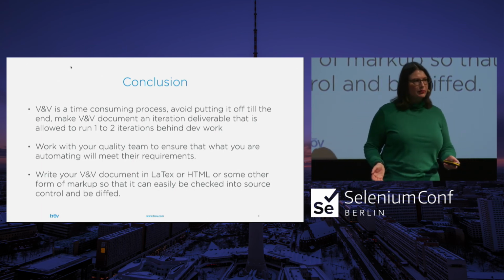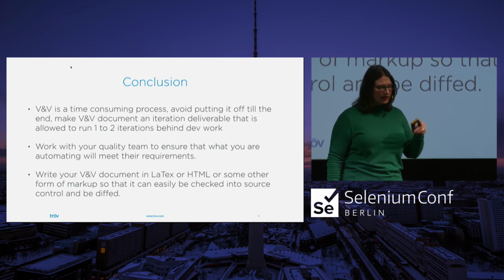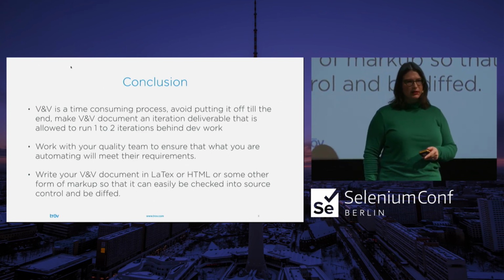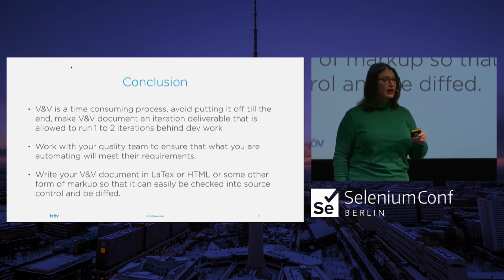And that wouldn't have mattered, because they don't get in the way so much of your development process, but that document needs to be right. And it needs to pass. And if it doesn't pass, you need to have a plan for how you're going to fix that.